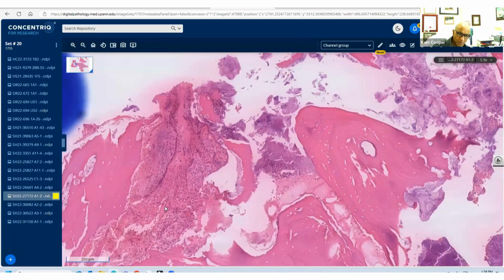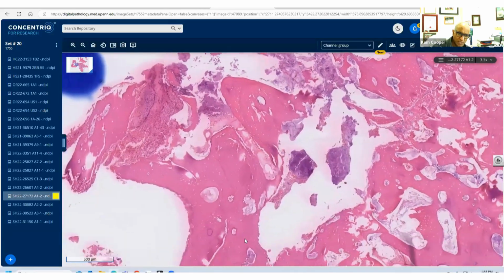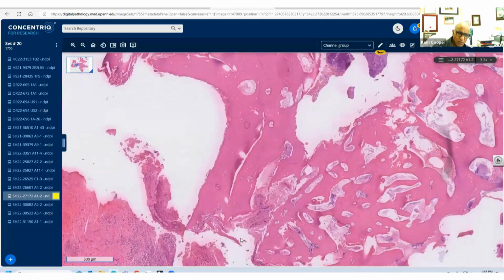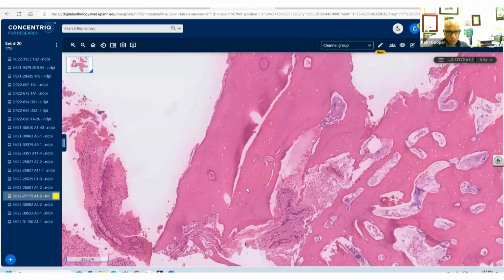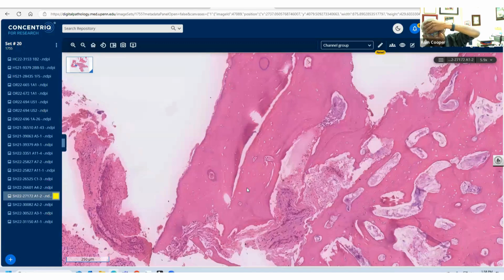All right, so not all of this is squamous cell carcinoma. And if you're unsure, then ask the surgeon, is there any mass there? Are you worried about squamous cell carcinoma? And they will tell you, nope, I'm not worried about it. This is purely osteonecrosis of the jaw. Remember that osteonecrosis of the jaw typically occurs in patients who receive bisphosphonates, which are given to build bone in patients with multiple myeloma, but they cause these erosions on the base of the gum and cause infection, and they can then cause acute osteomyelitis and osteonecrosis.